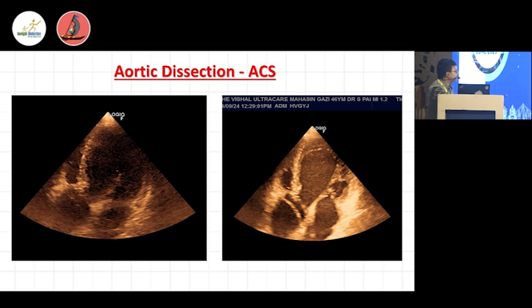There are different types of ST segment elevation we can get in ECGs. So it's not mandatory that all ST elevation with concavity is found to be pericarditis related. It all depends upon the clinical parameters of the patient's presentation along with the vascular territory it is supplying.